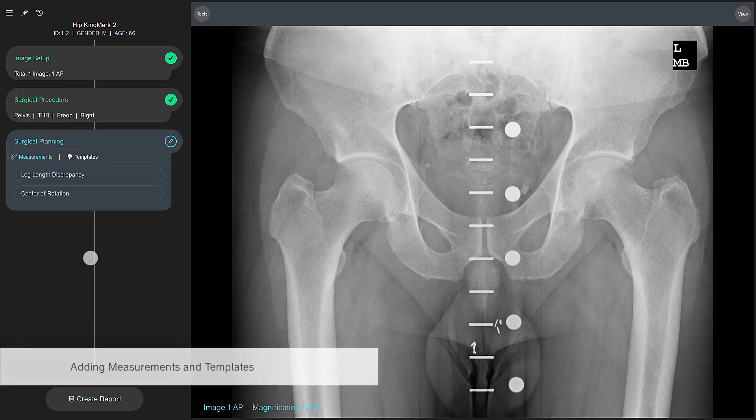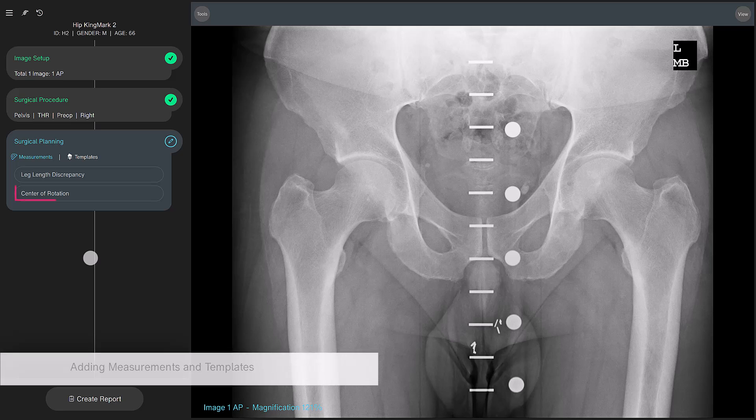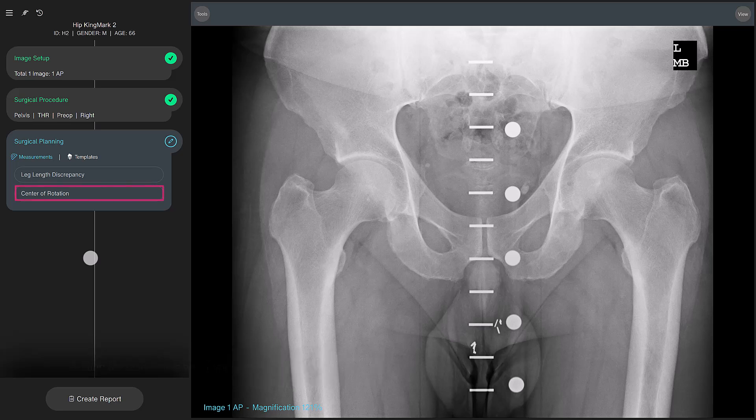Let's first add some measurements. The center of rotation tool gives you an indication of what the leg length discrepancy is, as well as the offset parameters. This constitutes the full evaluation of the anatomy of this patient.